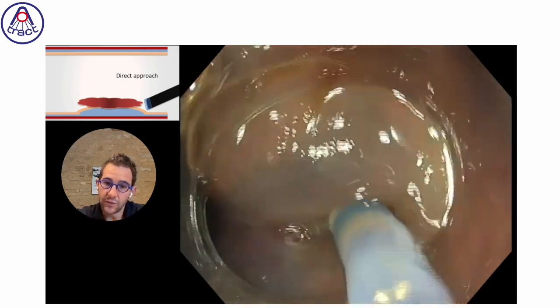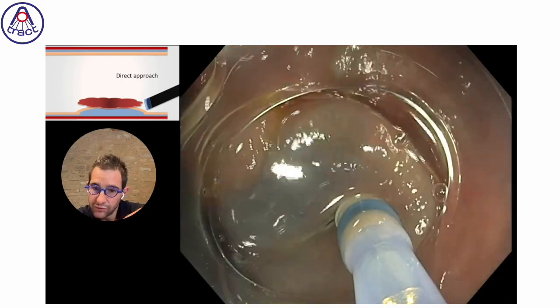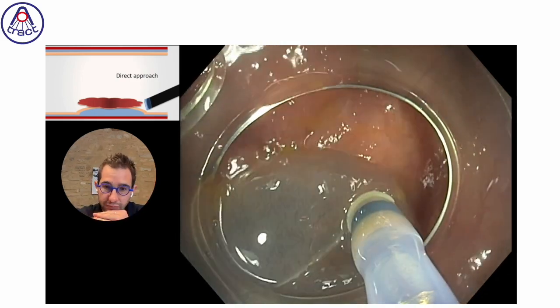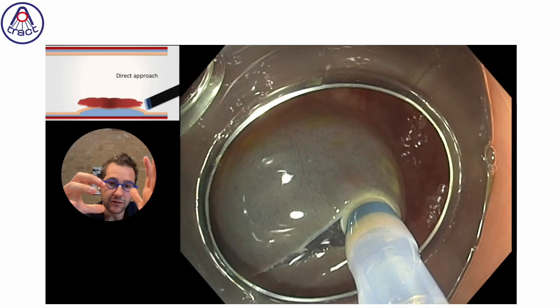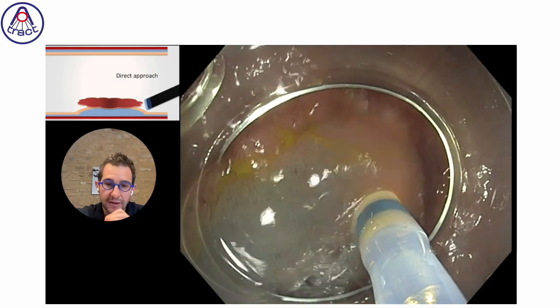And once again, we will do the incision by trying to make a pressure on the mucosa, torquing the scope in order to have more strength on the mucosa itself, to do an incision which is deeper from the beginning.